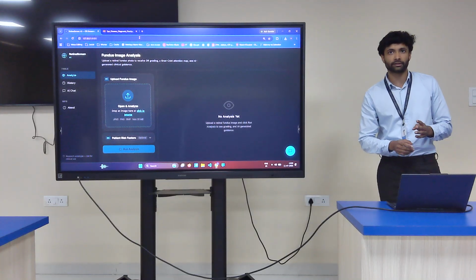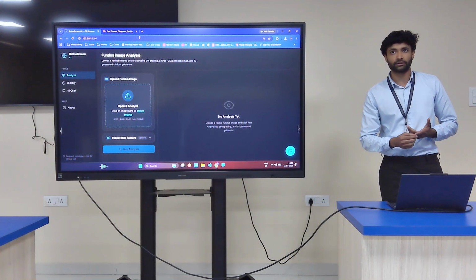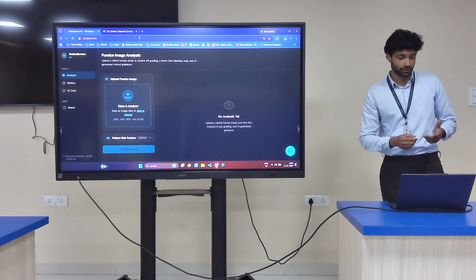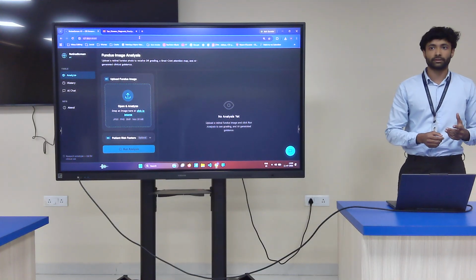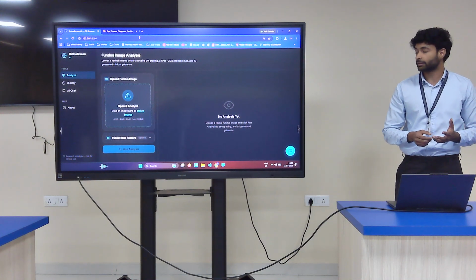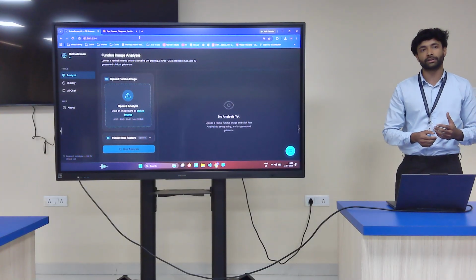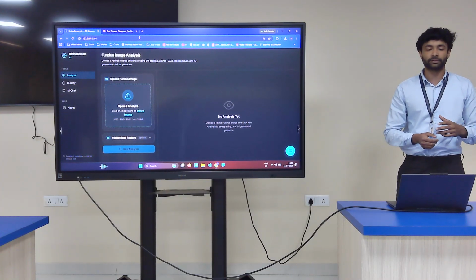The five DR cases are no DR, mild, moderate, severe, and proliferative. The model performs quite well with no DR, mild, and moderate diabetic retinopathy, but it does lack some accuracy when it comes to proliferative and severe, because it often confuses them as moderate.